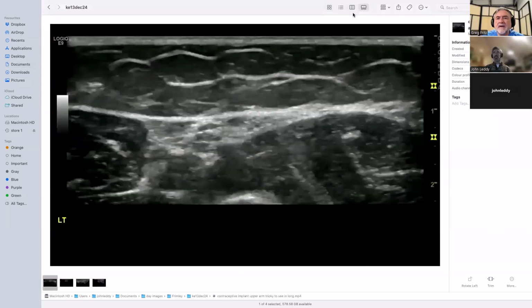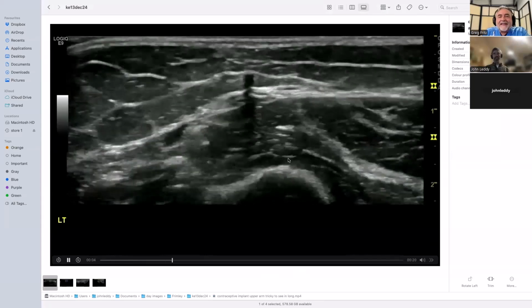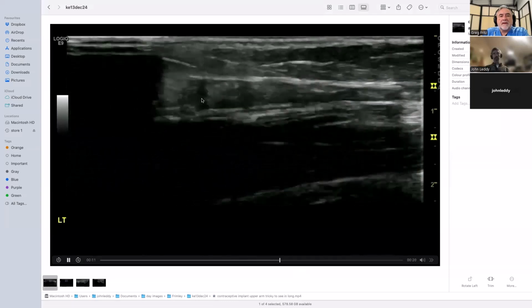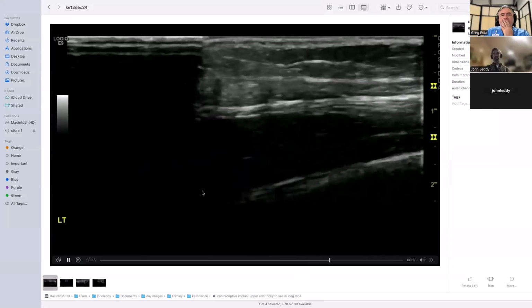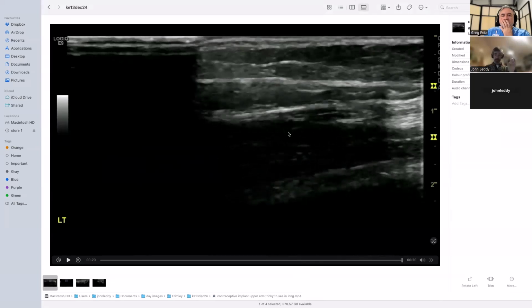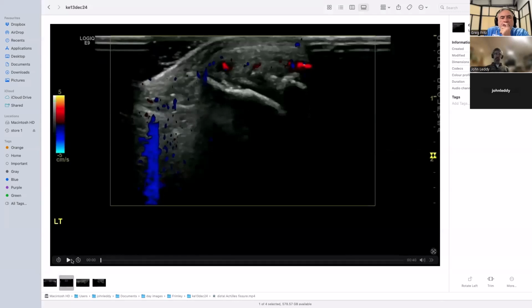So do you ever get asked to look for contraceptive devices in the arm? I've seen implants, some. Only as a function of saying, "Hey, can I look at that?" And this is that Norplant, I don't know which one it is. But yes, this was actually quite difficult to see in long axis, on a relatively good scanner. Some of them are easier to see than others. Usually you see a nice bright line in long view, but I couldn't get a good long view of this one. I think it was not the standard model. I don't know what that was.